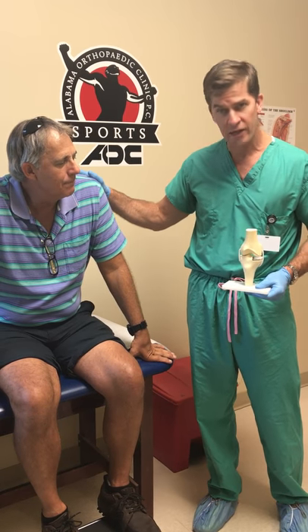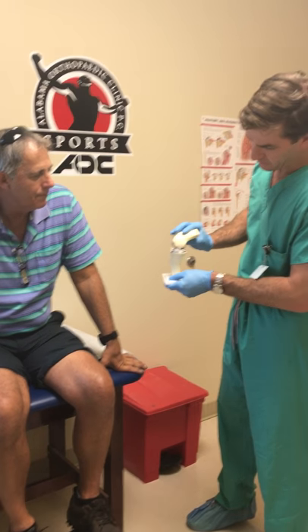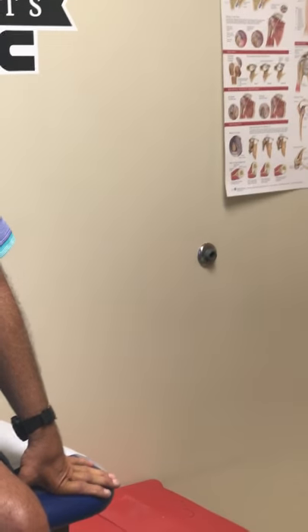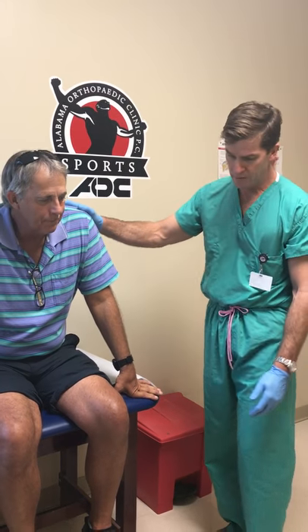Today we have Mr. Moro here. He's six weeks out from our partial knee replacement. You can see the model here of the partial knee replacement and what that is. He actually had a custom implant put in and we did it in our surgery center downstairs. So I just wanted to show you briefly what he can do.